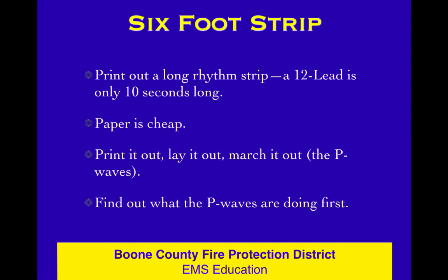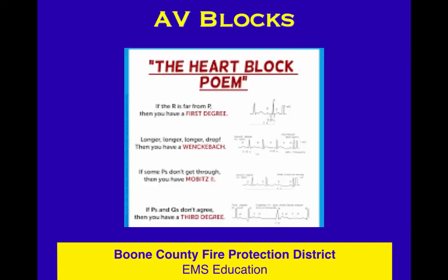That's why the bench seat in the ambulance is as long as it is. That's so you can lay that EKG strip on it. Use those big old long strips. You don't need more leads, you need more paper. So that is what will help you the most with AV blocks.